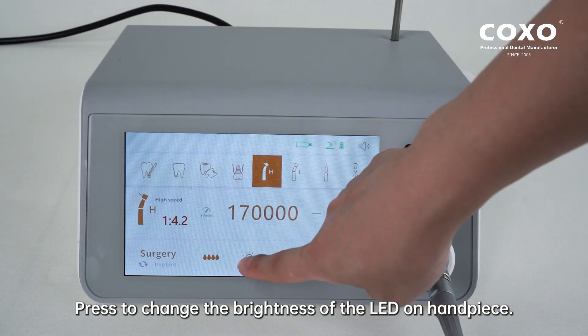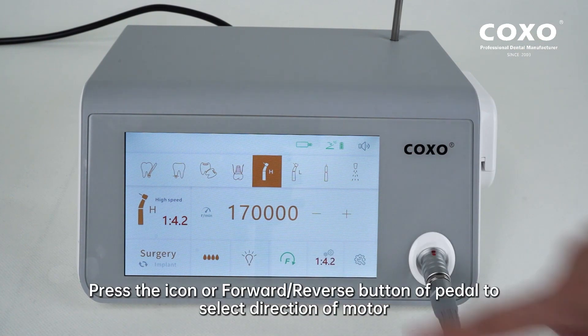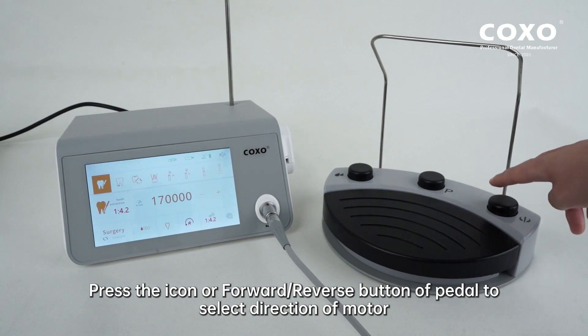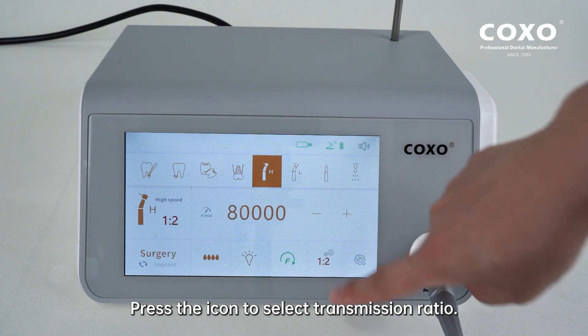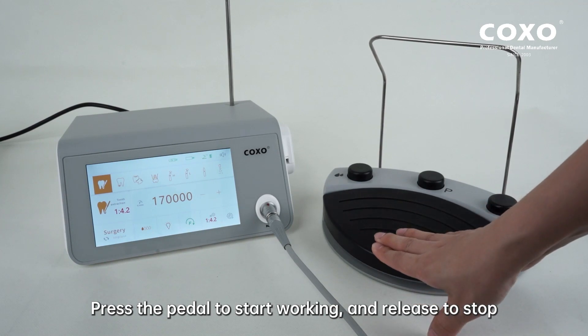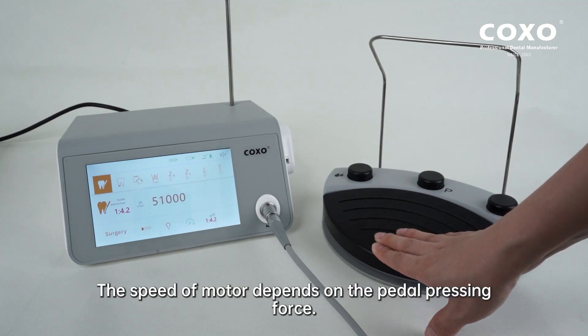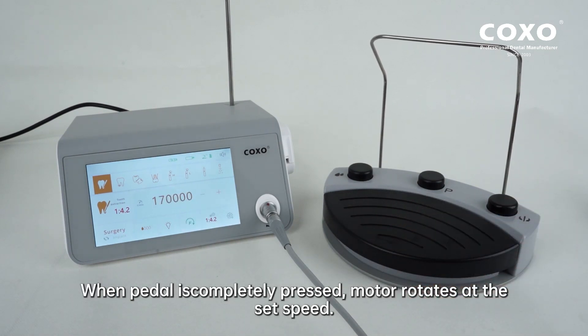Press to change the brightness of the LED on the handpiece. Press the icon or forward/reverse button of the pedal to select the direction of the motor. Press the icon to select the transmission ratio. The transmission ratio chosen must be consistent with the handpiece. Press the pedal to start working and release to stop. The speed of the motor depends on the pedal pressing force. When the pedal is completely pressed, the motor rotates at the set speed.